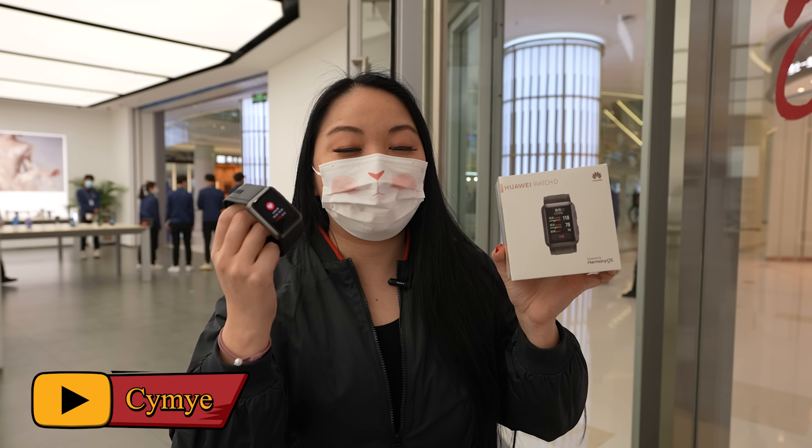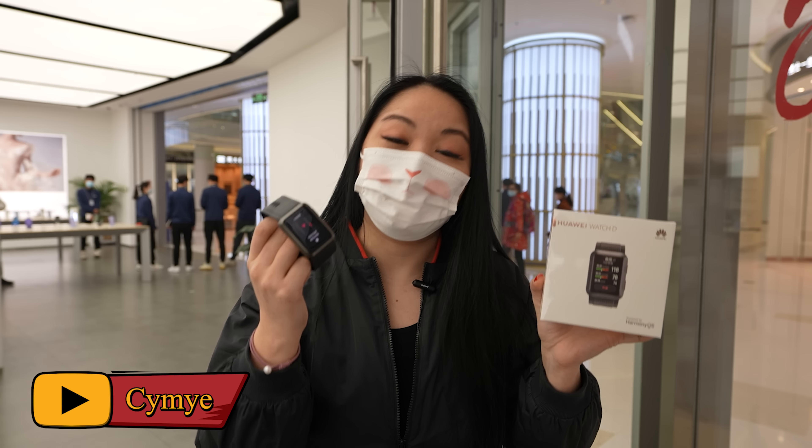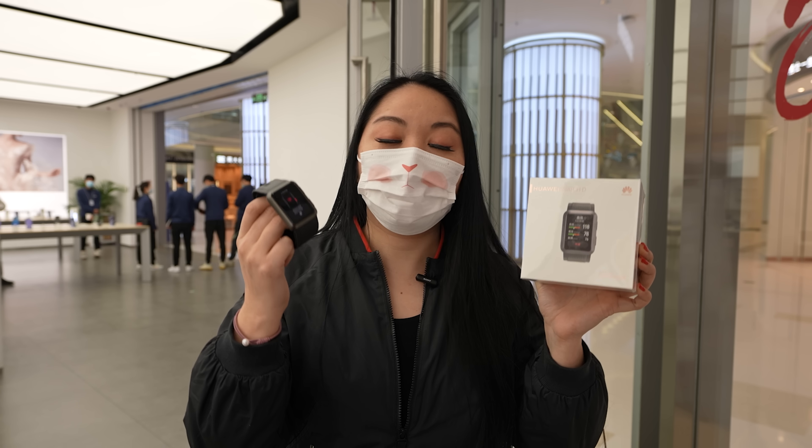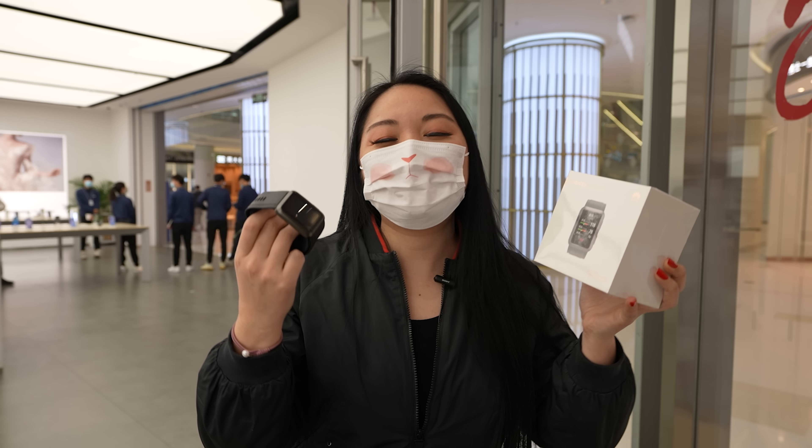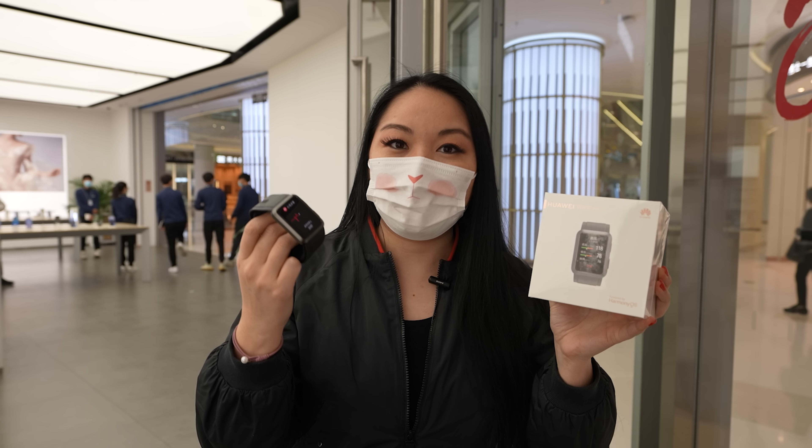Hi, I'm Simeon and today I'm going to show you the Huawei Watch D. This is the first smartwatch with a medical certificate that can measure your arterial pressure and also provide the electrocardiogram.